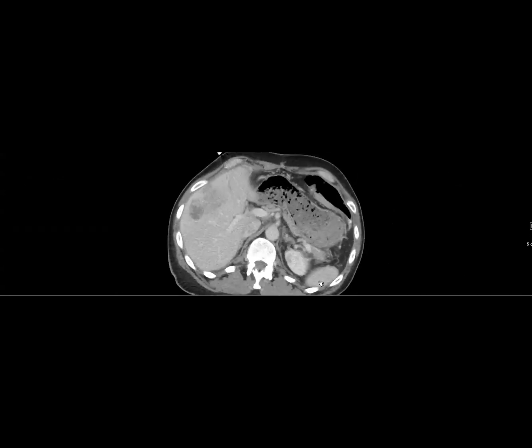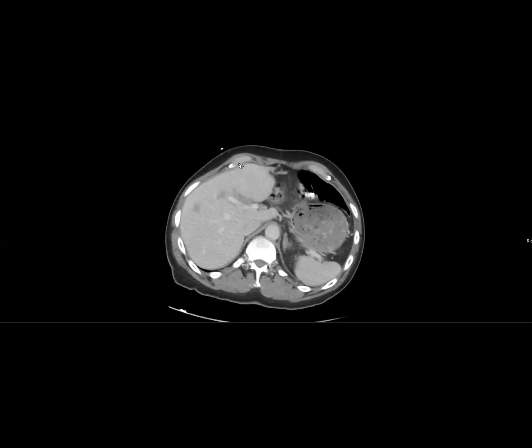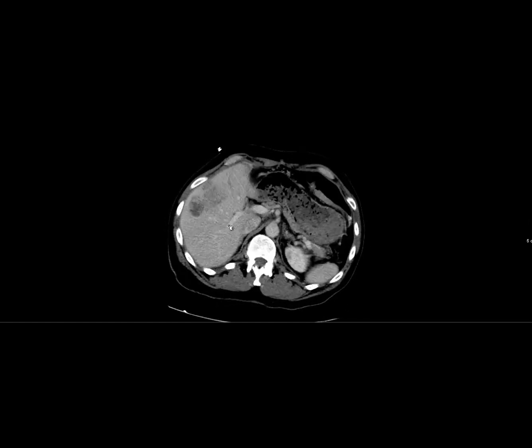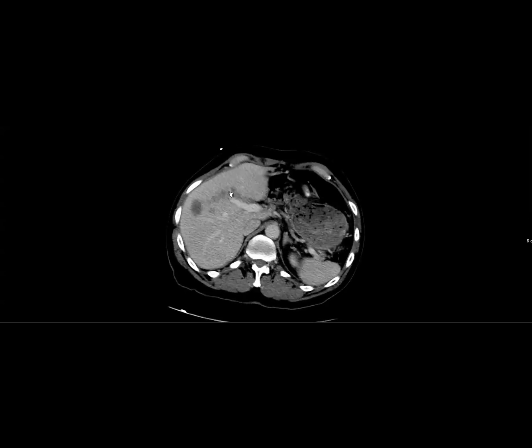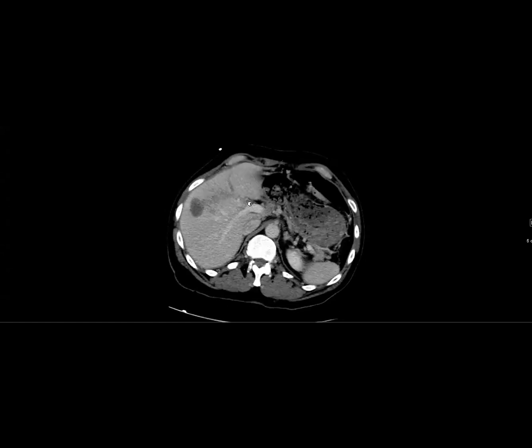The final case I have is a patient who came in. They have a history of colon cancer, and this is just an interesting, unusual thing that in this case, the patient's colon cancer mets did. So you can see obviously the patient has a bunch of big mets. But what's interesting here is that if you pay attention here, this tumor grew into a bile duct there. So you can see common bile duct, and then it just grew into the right intrahepatic bile duct. So this is very unusual for non-cholangiocarcinomas to do this, but in this case, it did happen.